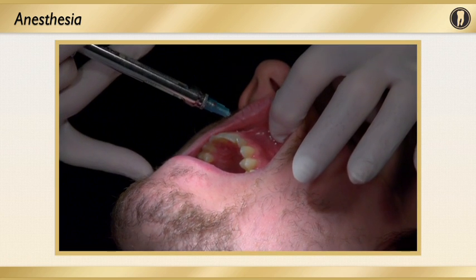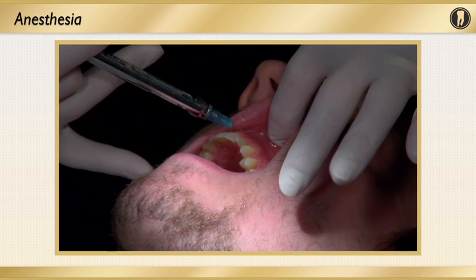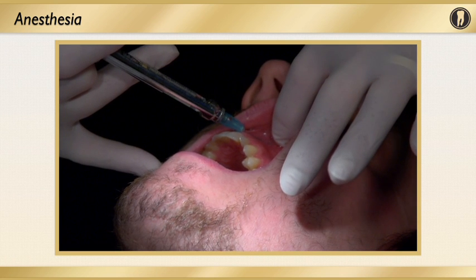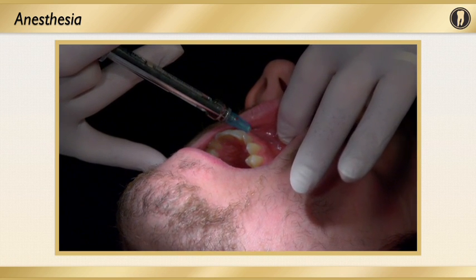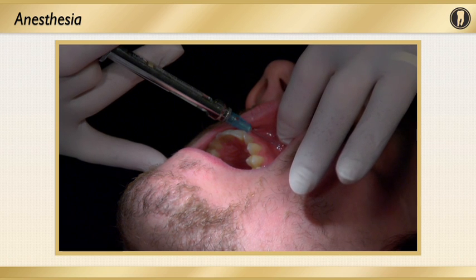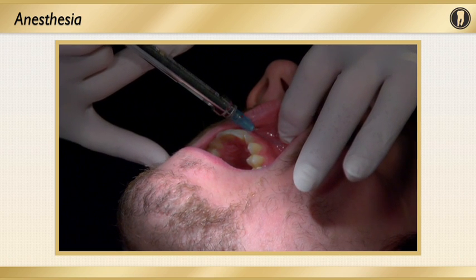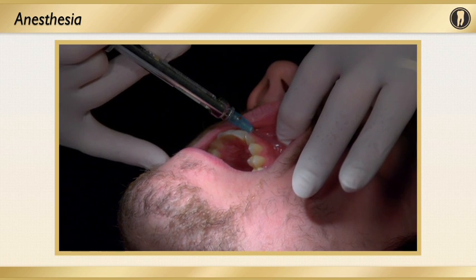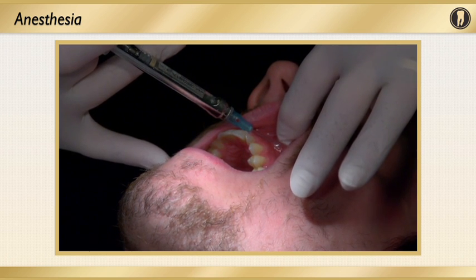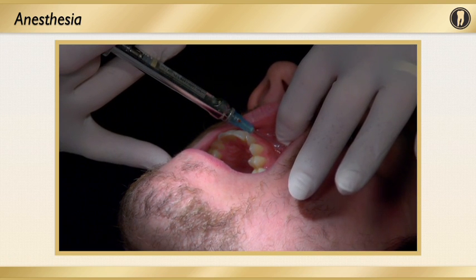The next thing I do is an infiltration with carbocaine. I use carbocaine because I just find it's probably the least painful injection out of all the anesthetics. You don't have to use carbocaine, but I just find that it seems to be a little more gentle on the patient, especially when you're treating kids that have had trauma and they're already scared and sensitive. You try to be as nice as you can.